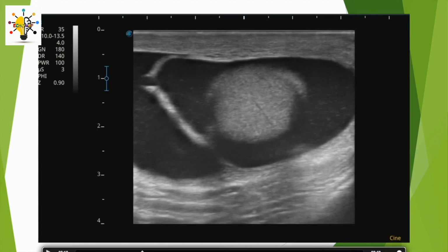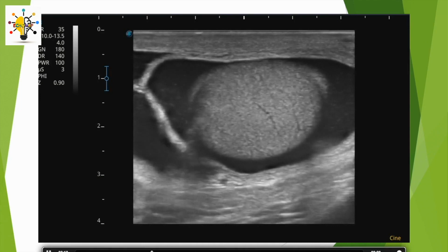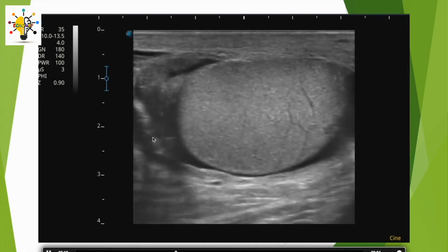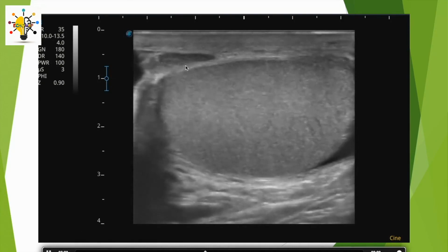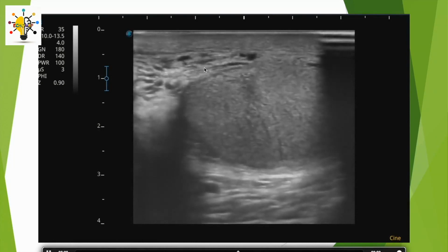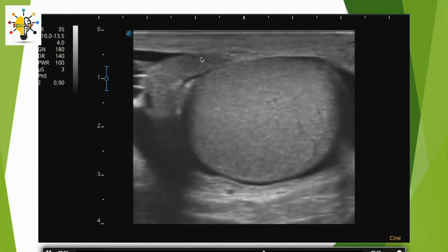Especially since, always stay close to your clinic, the patient feels pain at the time of the ultrasound. He feels pain when the probe is passed. You can clearly see the epididymis, which covers this testicle. And then, when we get to the head of the epididymis, you can see that the epididymis is quite large and will give way to the spermatic cord here. So, to locate the spermatic cord in hernias, you can also start at the epididymis and simply follow it.